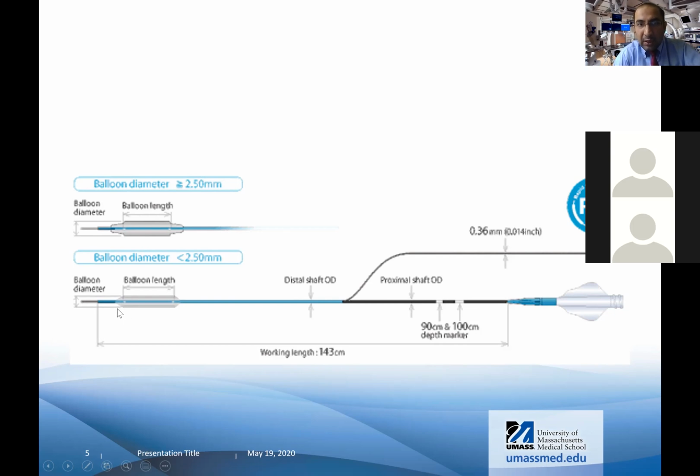Sometimes a lesion is difficult to get in, so you can get this balloon in and inflate. It's like a fulcrum or a chisel that will work. And then there are two tubes going inside this shaft. One is through which the contrast goes into the balloon, and one is the wire shaft.